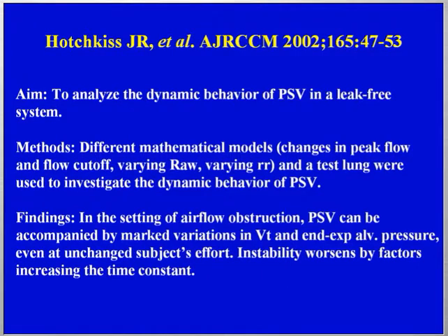Again, this is another interesting study by John Hotchkiss and John Marini's group, a bench study trying to analyze the dynamic behavior of pressure support in a leak-free system. The authors analyzed different mathematical models which resemble different changes in peak inspiratory flow, different cutoff values for the switch from inspiration to expiration, varying inspiratory resistances and varying respiratory rates.